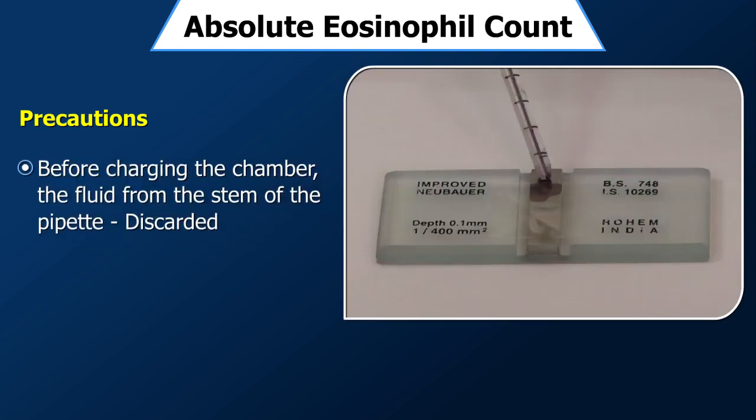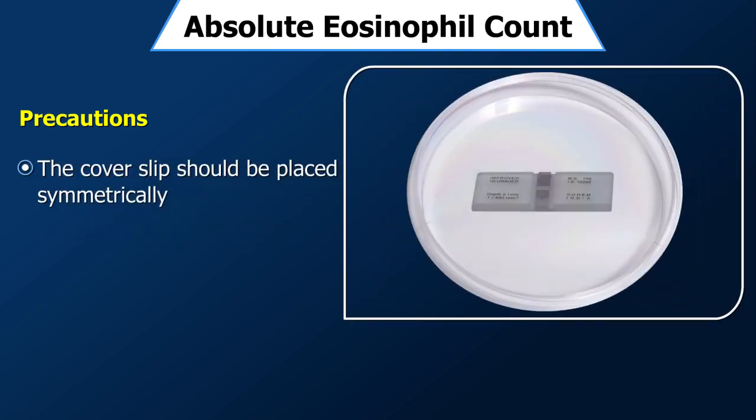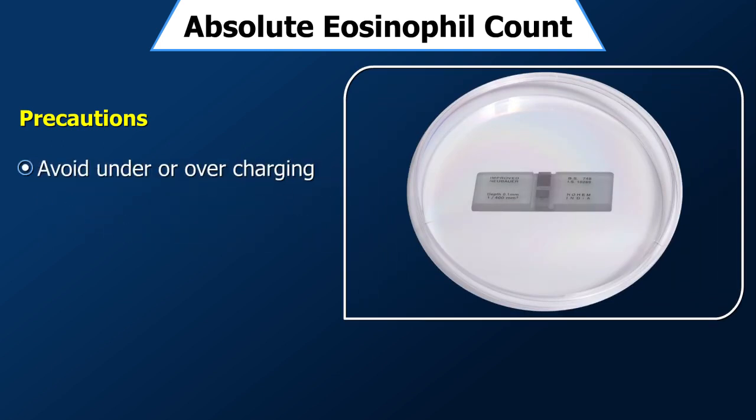Before charging the chamber, the fluid from the stem of the pipette should be discarded. The cover slip should be placed symmetrically so as to cover the ruled area completely. There should be no under- or overcharging of the chamber, as the count will be low in both cases.